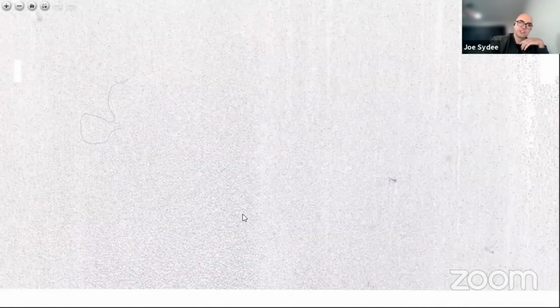And also, when you're looking at low power, it's good to assess the whole slide to see the quality of the smear. You probably don't want to see large ridges of thicker areas of film where the red cells and white cells come together more, and then thinner areas, because when you do your differential, you may not get an accurate differential of your white blood cells. But now we've assessed that it's a well-made smear and that there's no platelet clumping.